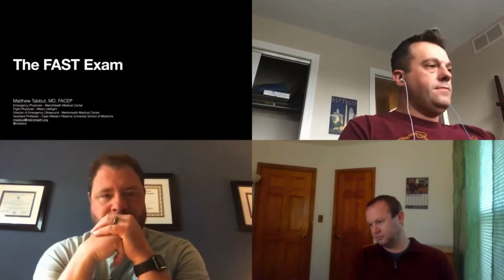I posted a video this week about the basic FAST back in the archives. For the basic FAST, we've certainly been going over that. But today I want to talk about the FAST exam from a unique perspective. I want to take some cases that we've had over the years and dive into them, and look at some nuances in the FAST, things that aren't quite as straightforward as the traditional, here's your 4 quadrants. So with that being said, let's dive right in and talk about the FAST exam.